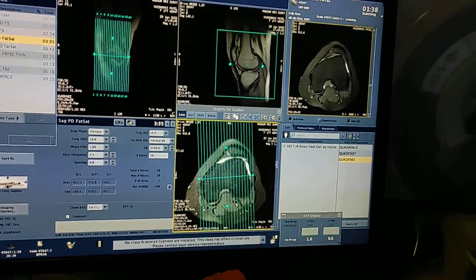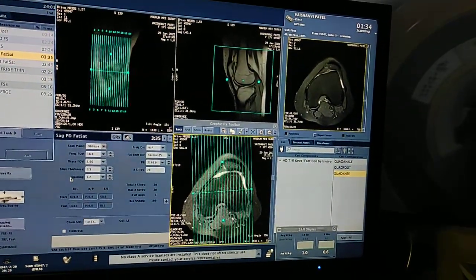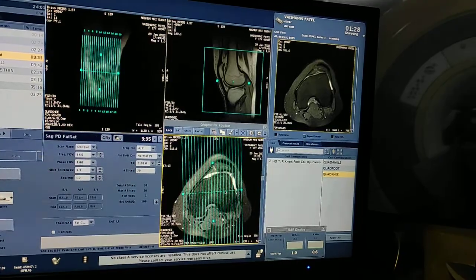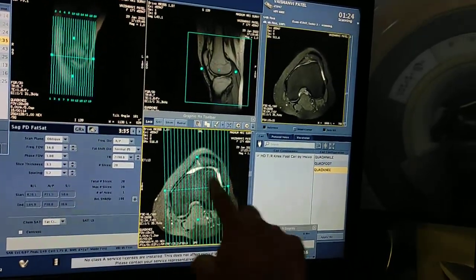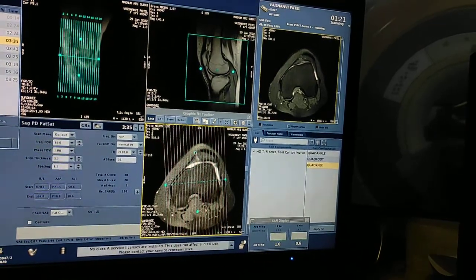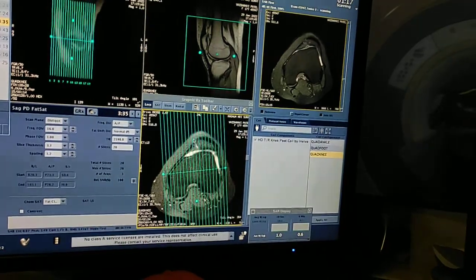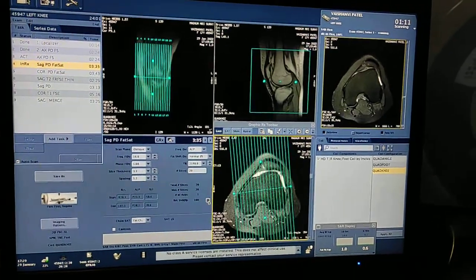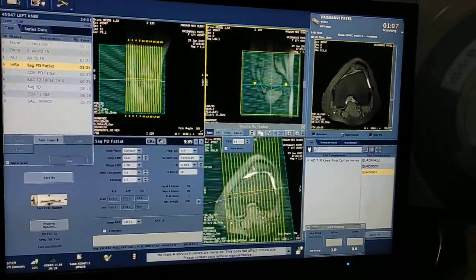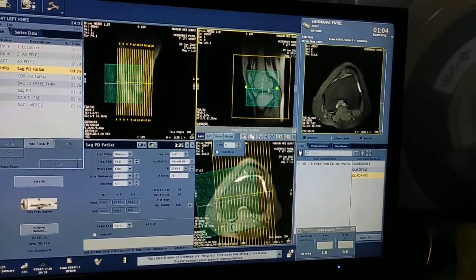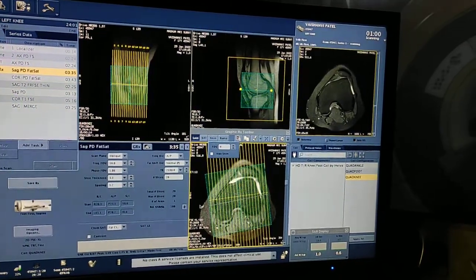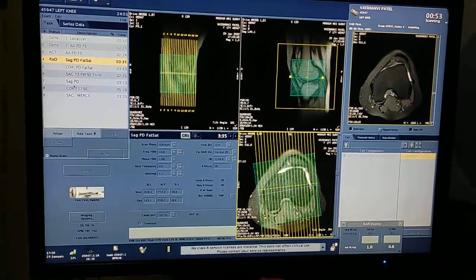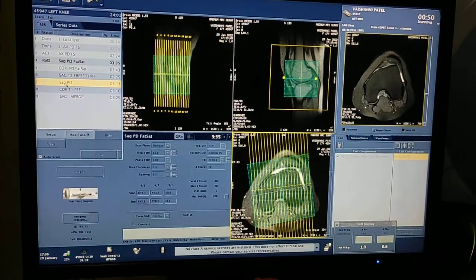The patella is dislocated. I am increasing the spacing because the lateral image is not fully covered. Keep in mind both condyles and take the images perpendicular to both condyles. My sagittal FS PD planning is ready. Put the shim on the images — as I told you, the shim reduces noise and gives better images. My sag FS PD planning is now complete.